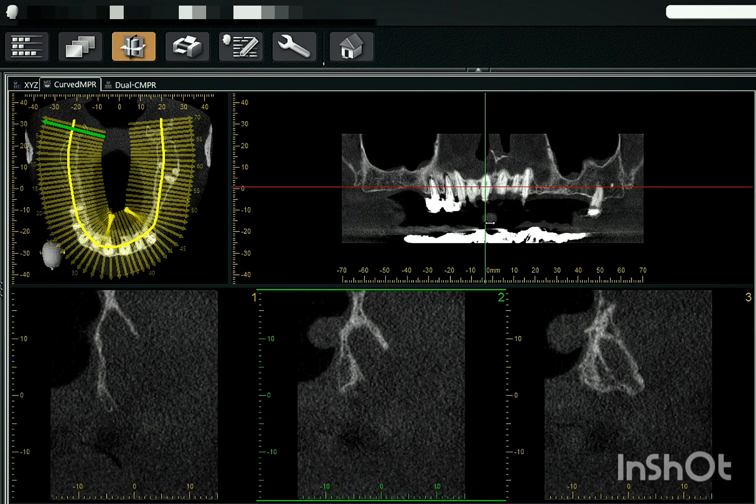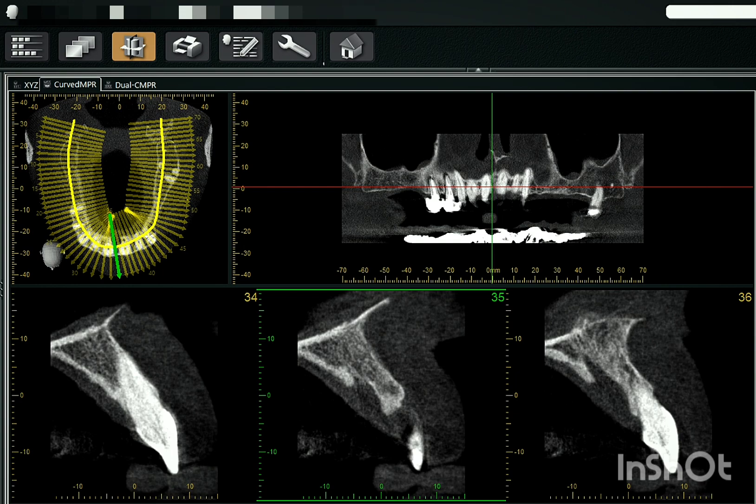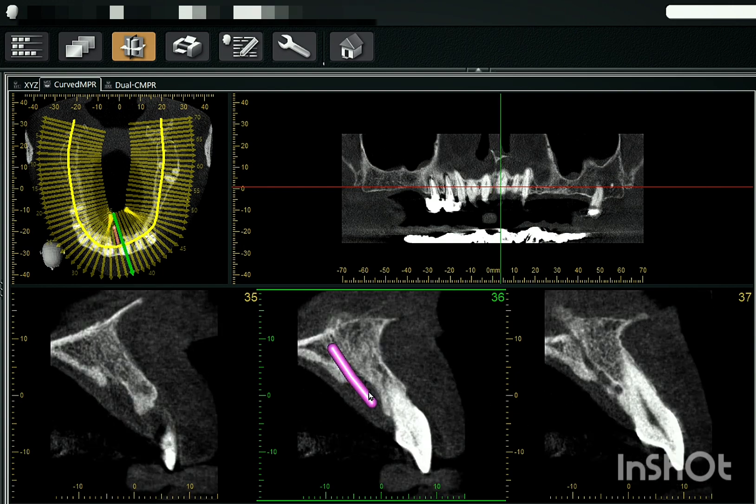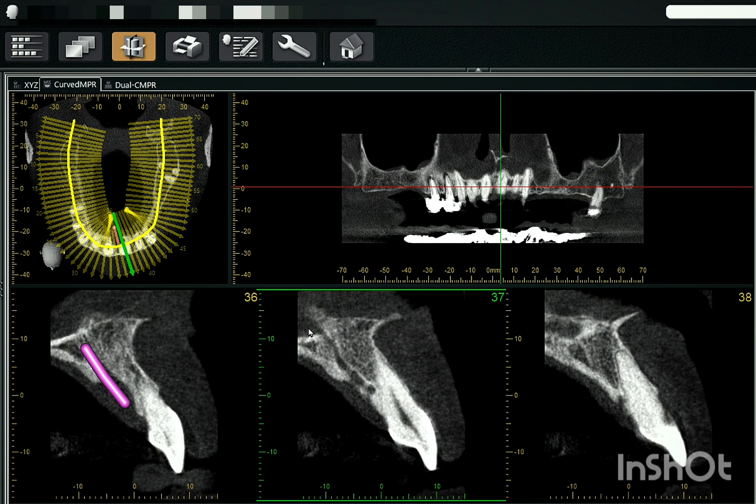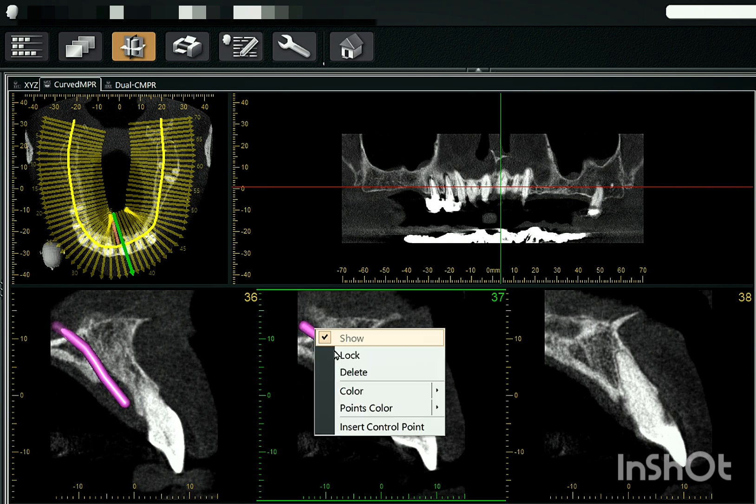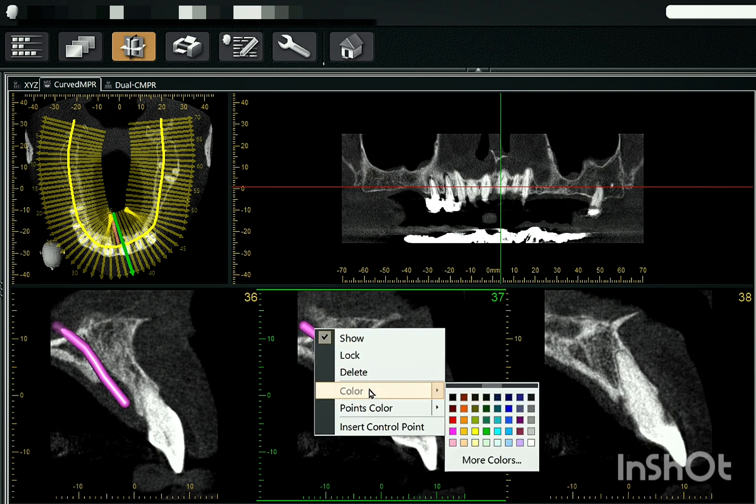So coming to the first nerve tracing of nasopalatine nerve or the incisive nerve canal. Approximately we'll do the nerve tracing. This was of incisive nerve canal.